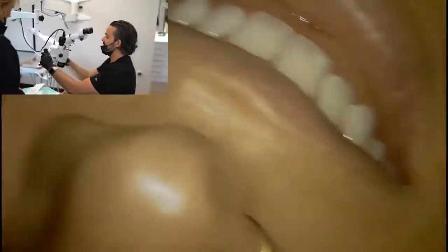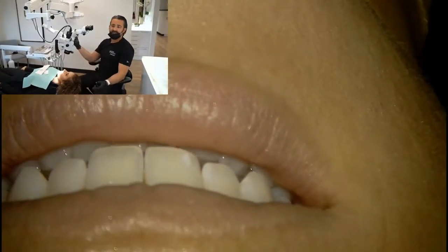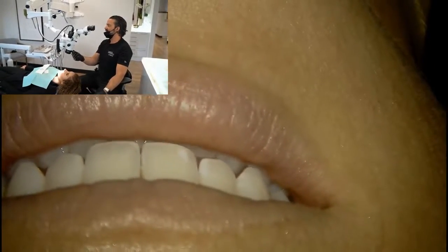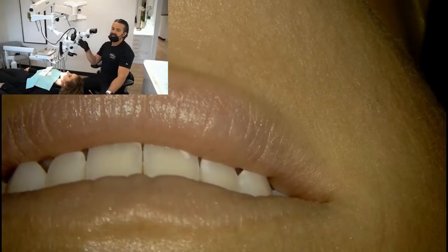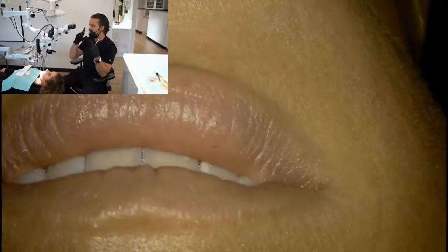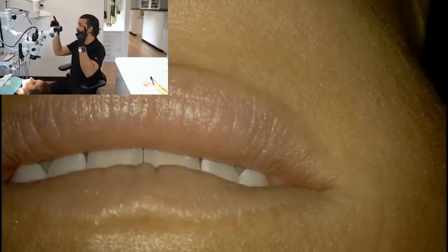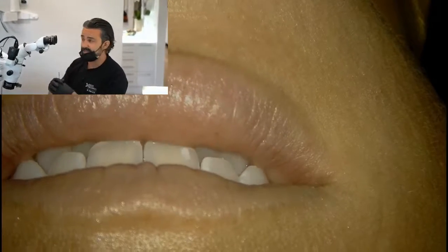All right. The other thing, we live in this social media world of today, and I'm a Gen Xer, so it's not a big priority for me like the millennials and beyonders. But video documentation is really augmented with a microscope. When you go cameras off your loops, everywhere you look around the room, you're recording, and it makes the audience seasick, as well as your assistant.